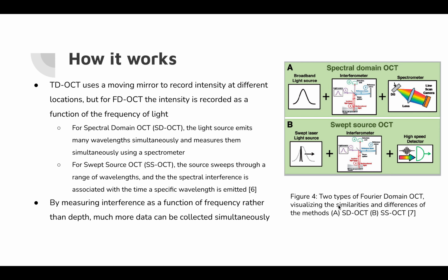Swept source OCT uses an interferometer with a narrow line width, frequency swept laser, and detectors to measure interference versus time. The laser frequency sweep essentially labels different time delays, which are then detected by interference. Swept source OCT has the advantage that it does not require a spectrometer and line scan camera.